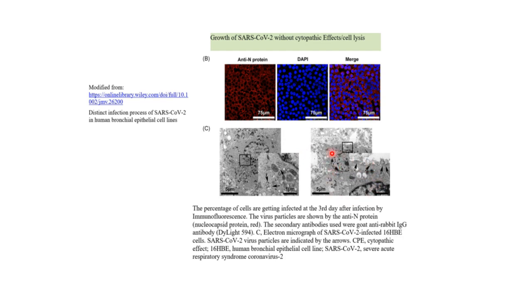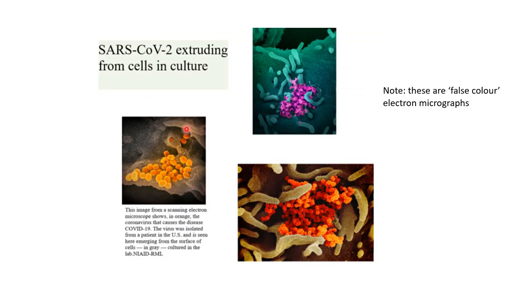And they're quite healthy cells here, and you can see virus SARS-CoV-2 being extruded from the cell at the electron microscope level. So here is the virus coming out of the cell. The cell looks reasonably healthy, and the virus particles are pouring out by, I would guess, exocytosis or a similar process.